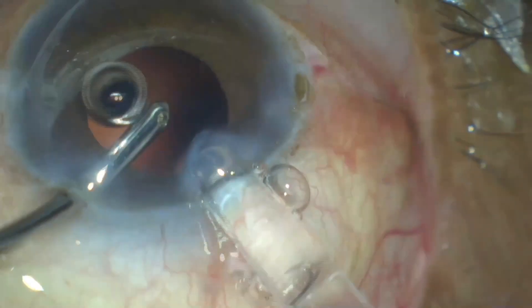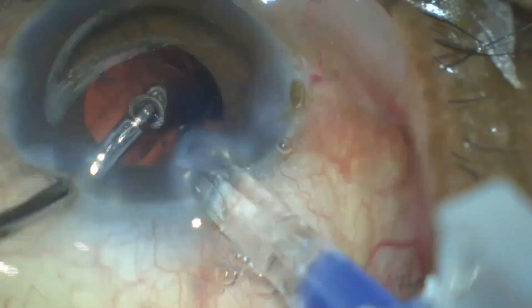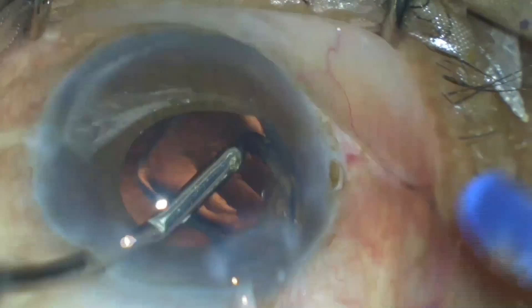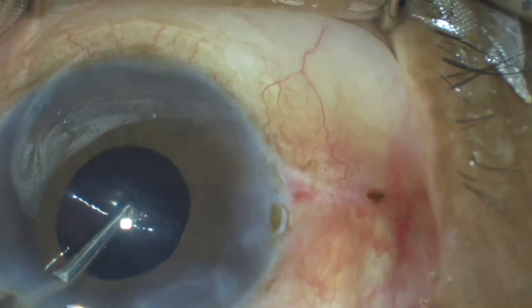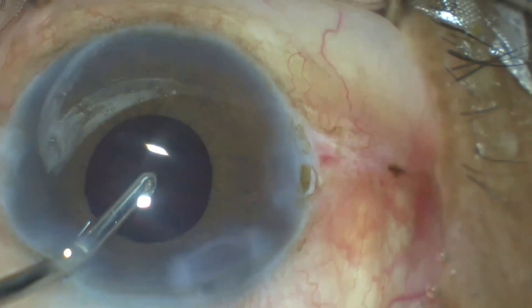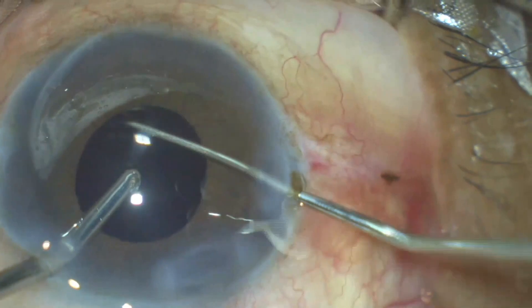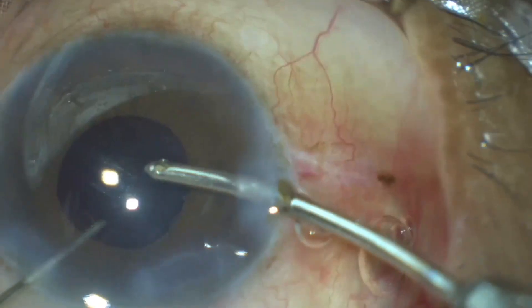We must carefully check whether both haptics are open in the bag. Sometimes one haptic may remain folded or may remain in the sulcus — or both — in cases of mid-dilated or over-dilated pupils. As you can see in this case, one has to inject the leading haptic towards the back and press down the optic and trailing haptic, then wait a few seconds for natural unfolding of the IOL. Confirmation of in-bag implantation must be done by retracting the iris with a second instrument.